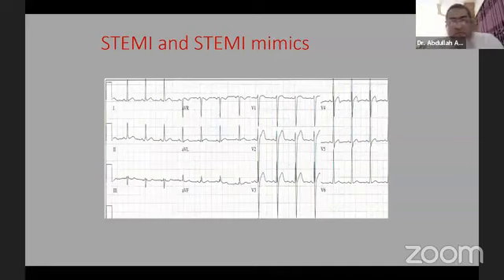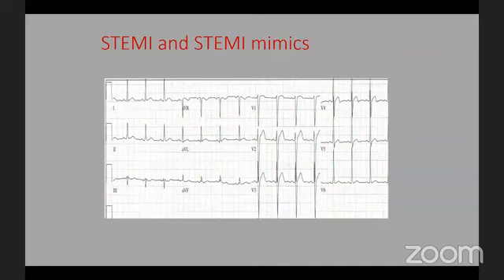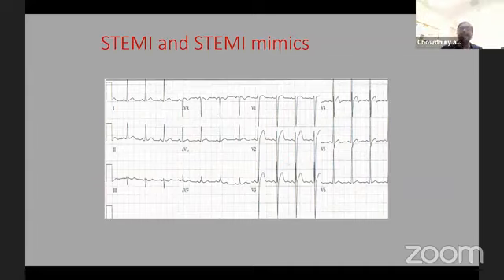It's not STEMI. 55-year-old diabetic hypertensive. Non-STEMI. So this is LVH related. Remember the voltage criteria, whether Sokolow or the Romhilt-Estes criteria.